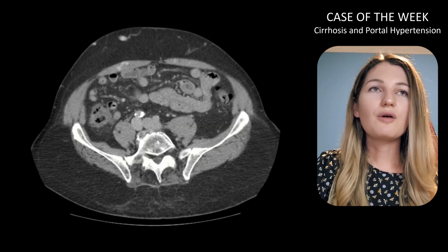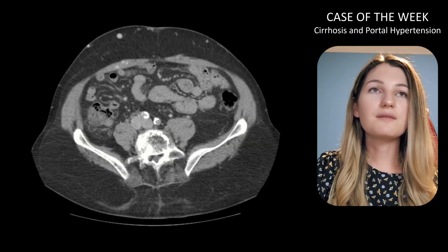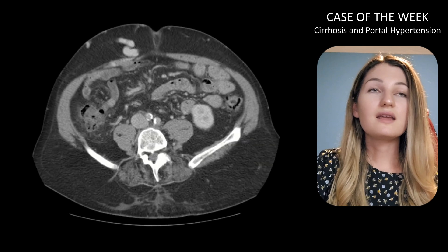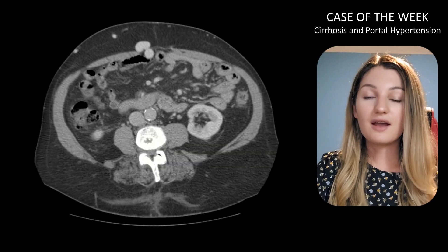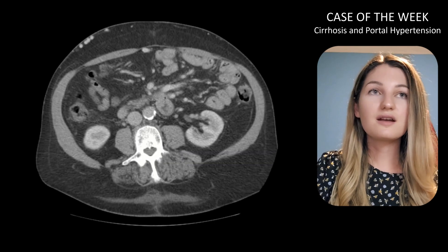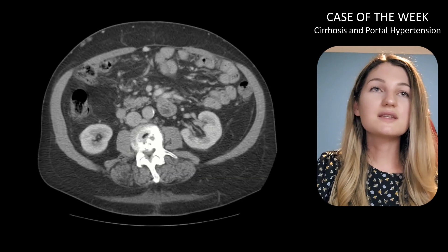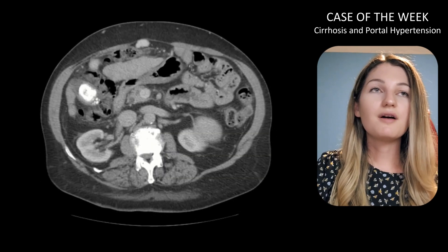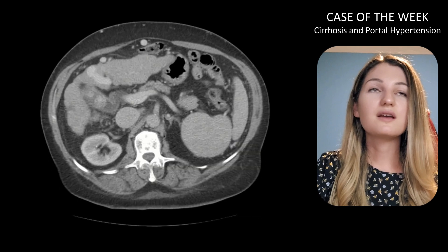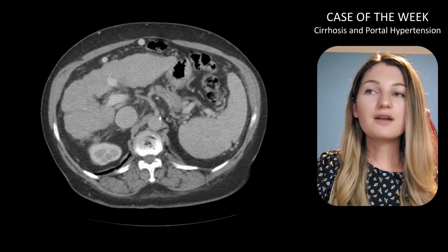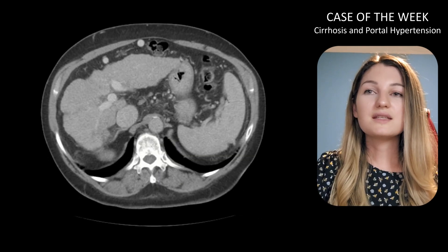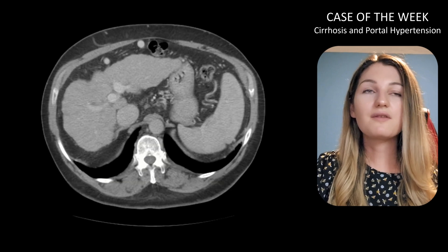While we're here, let's have a look at our overall peritoneum. We don't see any ascitic fluid — that's definitely a common finding in cirrhosis that we're not seeing here. Sometimes ascites likes to hide above the liver or around the spleen, but we actually don't see any here. Now that we've had a good look at the CT together, let's talk about these findings and how they all fit.